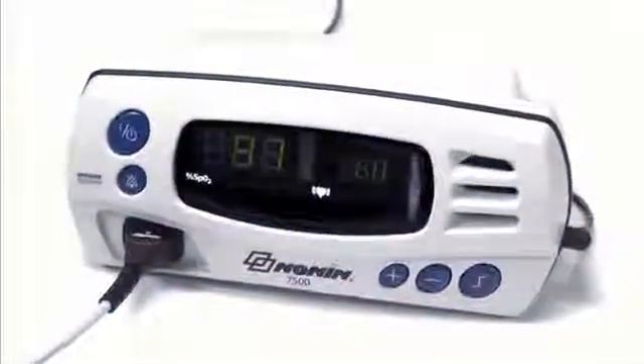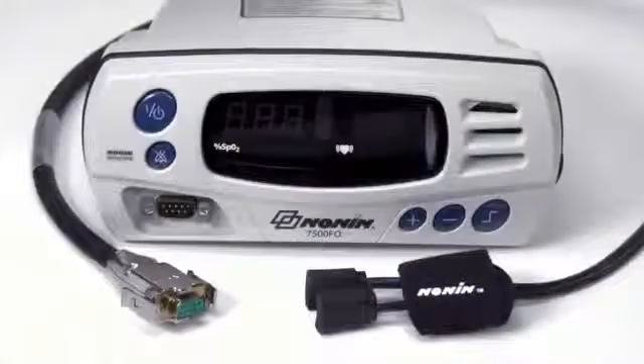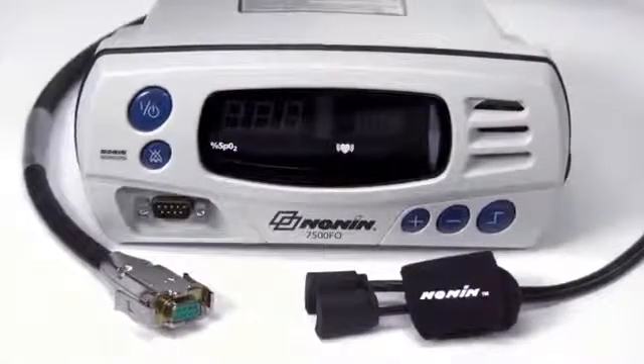With proper use, the Nonin 7500 or 7500 FO pulse oximeter will provide consistent, accurate oxygen saturation and pulse rate measurement.